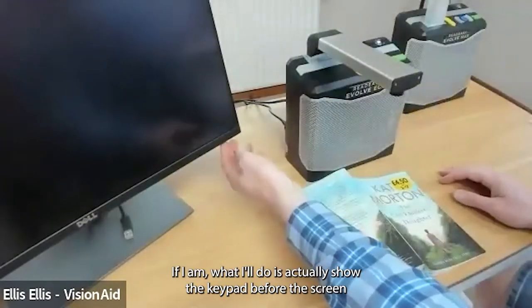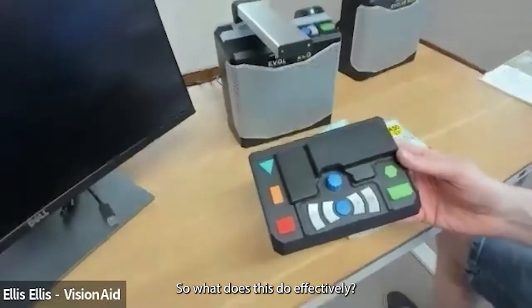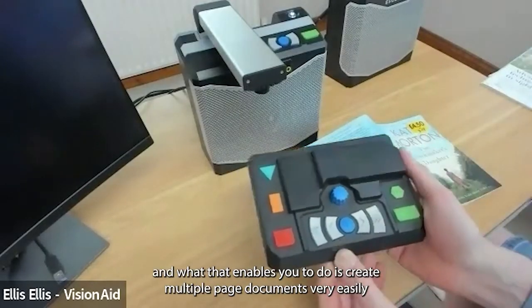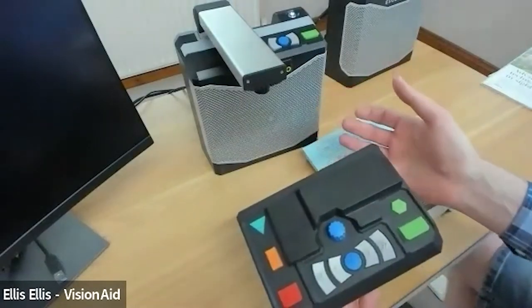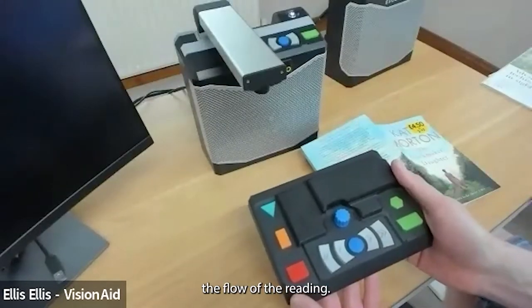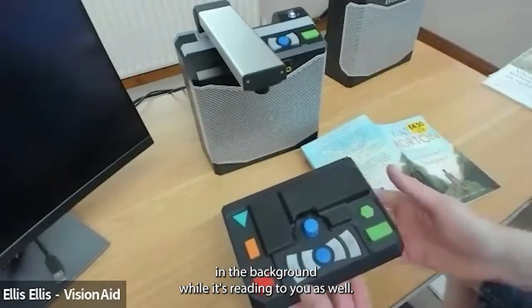On the back of the unit there's an optional feature pack that magnetizes on. For users with no usable vision it enables creating multiple-page documents — you can capture multiple pages and have them stored on the device to read from start to finish without interruption. For reading a book, five to ten seconds of processing time per page would interrupt the flow, so these devices let you capture while it's reading. You can capture the first page, have it reading aloud, and then capture additional pages in the background.